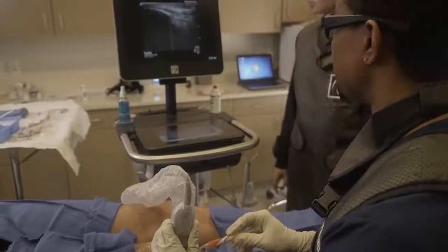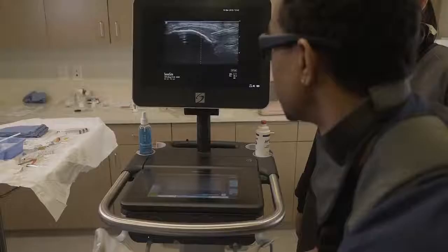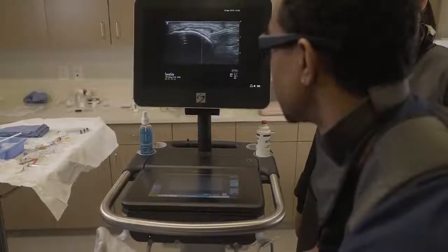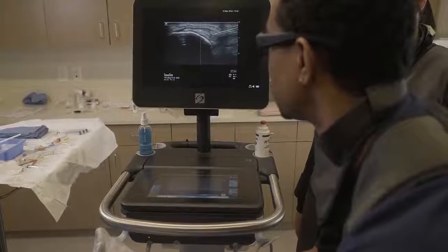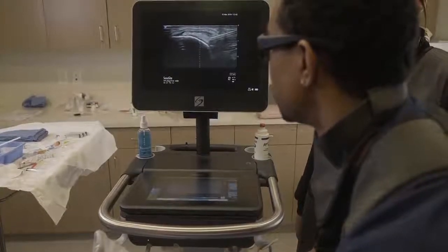Now we're going to inject the patellar tendon. Coming in, you'll just see the point right there in the middle. We're trying to fill in that tissue to make the patellar tendon strong, and we see that tissue filled in nicely — filling in that gap.